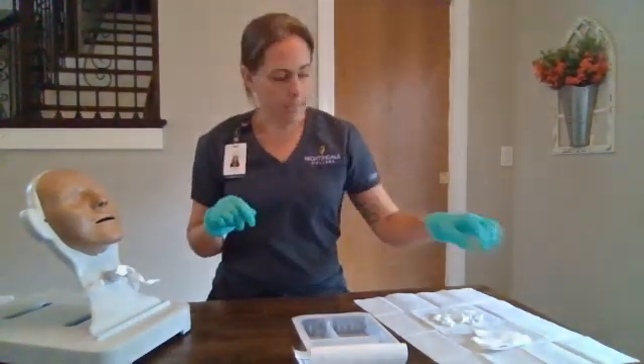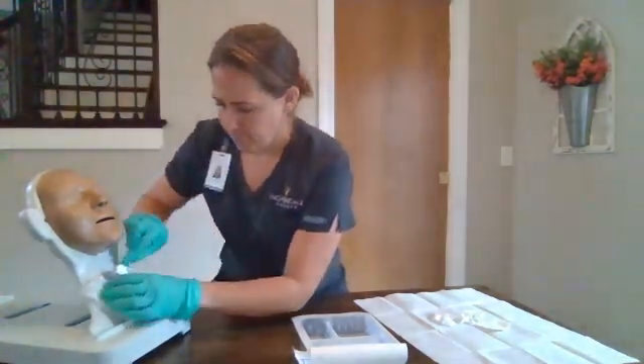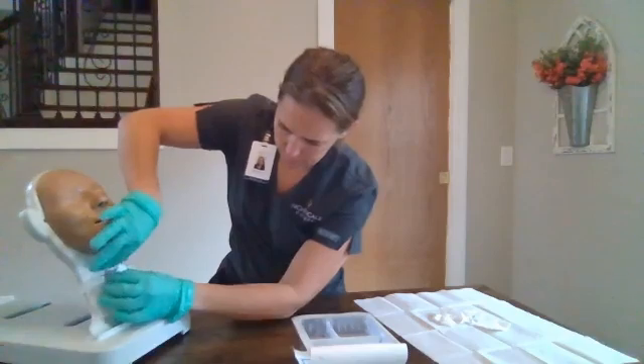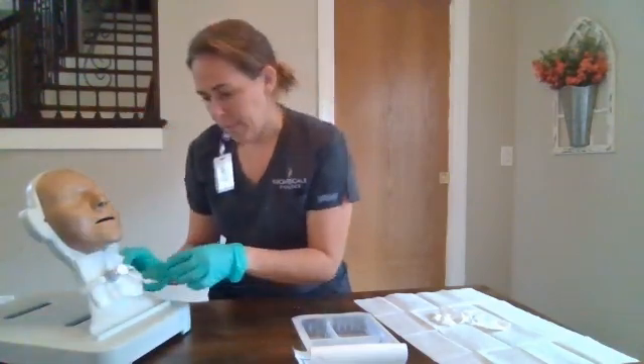We will take our sterile gauze and dry the skin and the flange. Then we're going to replace our dressing. Next, we're going to replace our tie.